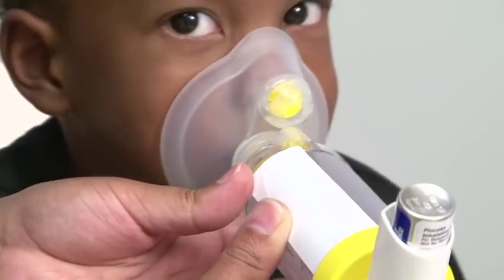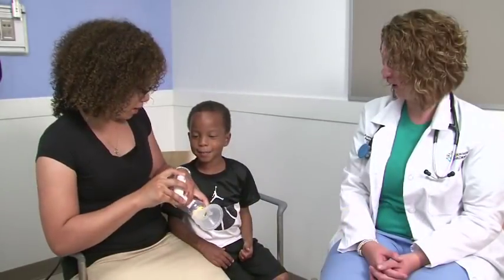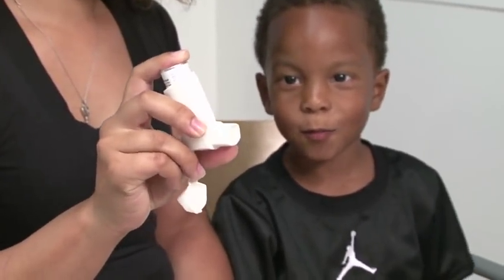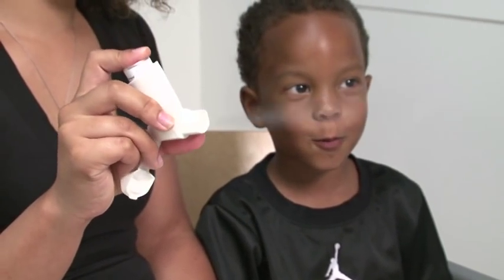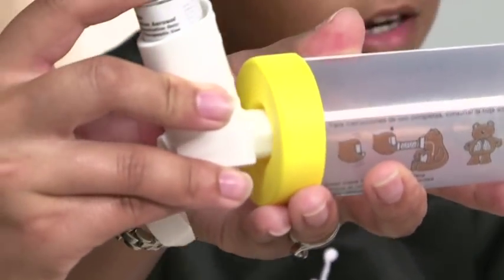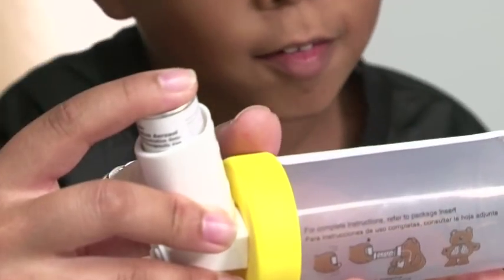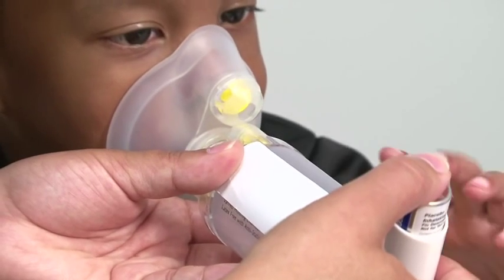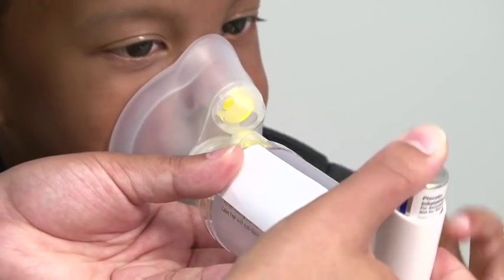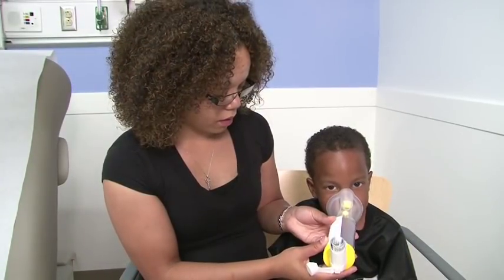Spacers with a mask on one end are used for smaller kids and babies. First, remove the cap from the bottom of your inhaler. When you get your new inhaler from the pharmacy, you need to prime or waste it by spraying the medicine into the air four times. Now fit your inhaler into the opening at the end of the spacer. Shake the inhaler well for 10 seconds. Place the mask tightly over nose and mouth. Push down on the inhaler once — now the medicine is inside the spacer. Breathe in and out six times through the mask.